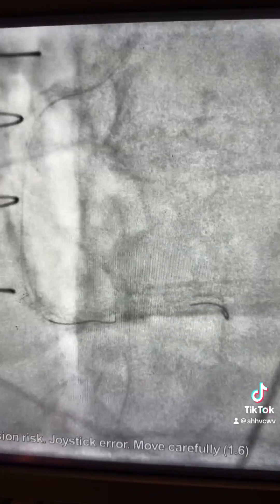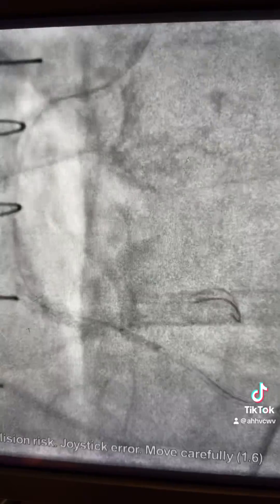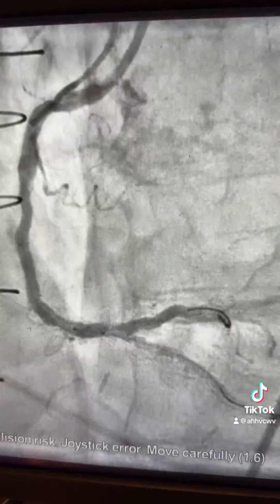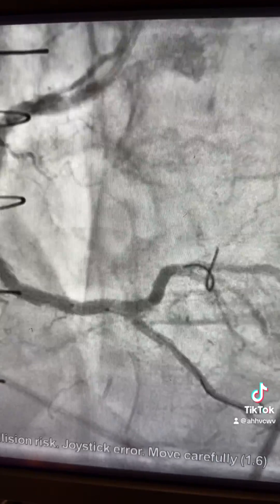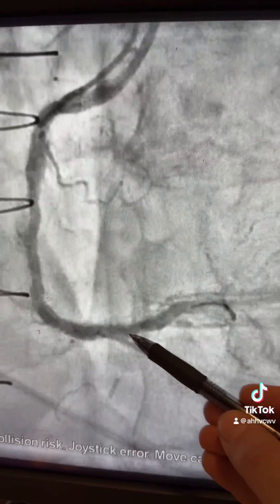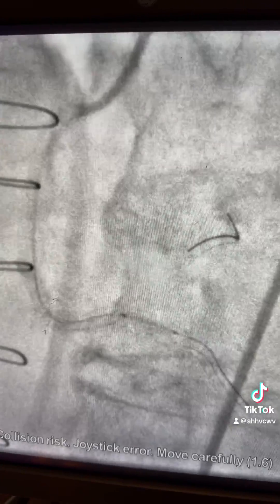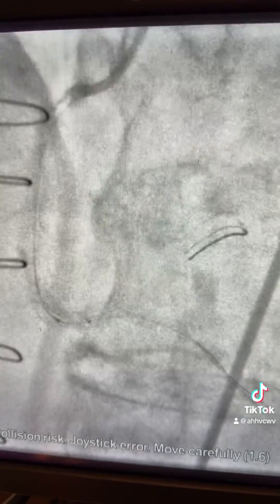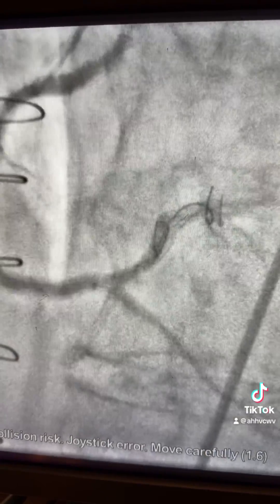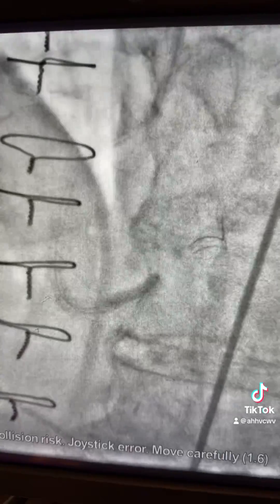After that, balloon the PDA, then upgrade the balloon. We opted for the T-technique: stent in the PDA, then another stent from the RCA to the PL. Stent placed in the PDA, then pull the balloon and wire toward the PDA and inflate.